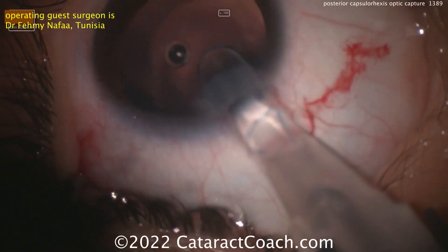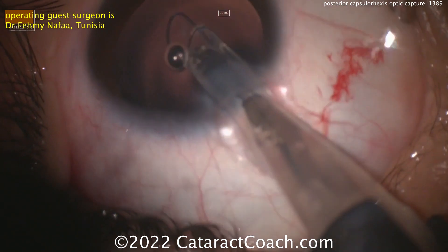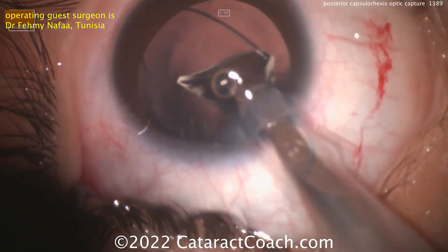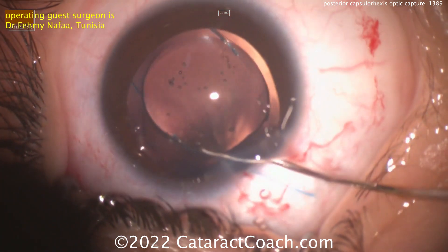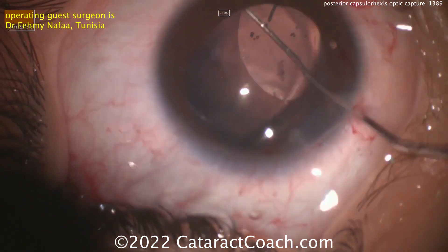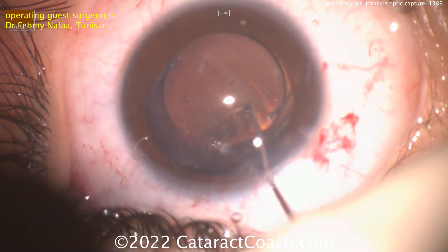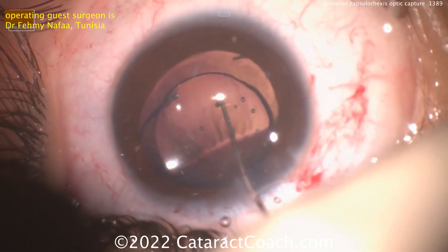Here comes the lens — looks like a three-piece acrylic lens, delivered nicely. The leading haptic is coming out and looks like it's going under the iris, into the sulcus. Here's the optic — looks like a six-millimeter acrylic optic. The trailing haptic is dialed in nicely and goes also into the sulcus. Now the optic can be buttonhole captured — you can go behind the anterior capsular rim or, like in this case, going a little deeper, placing it behind the posterior capsulorexis.